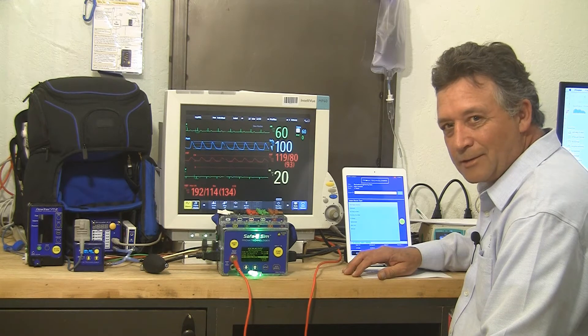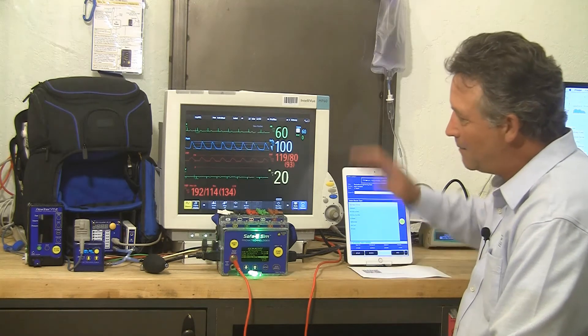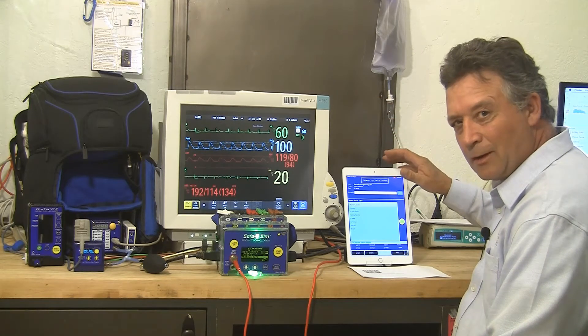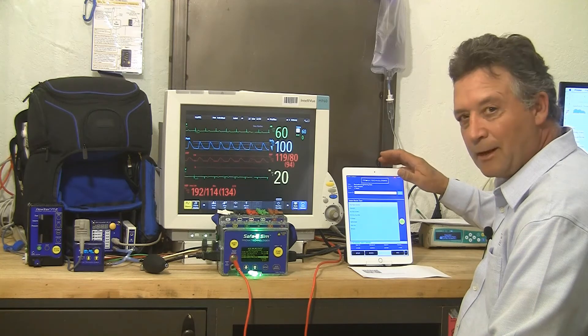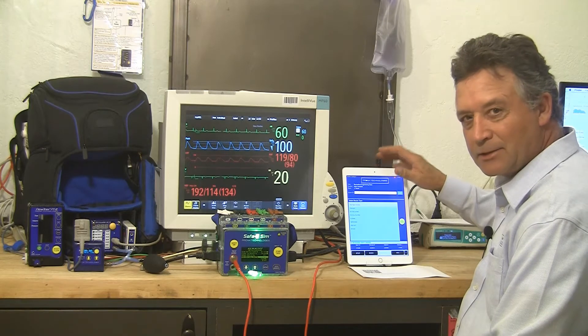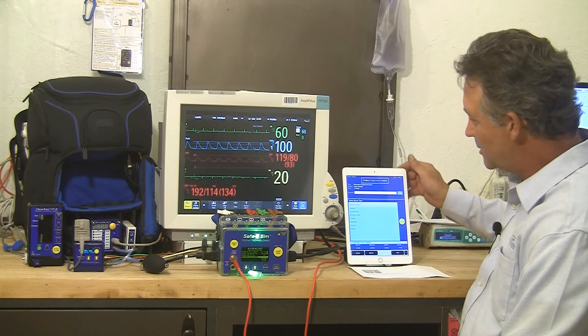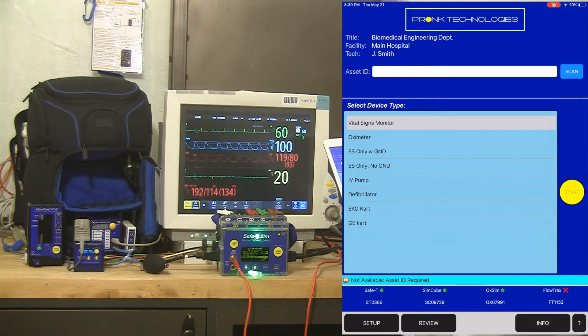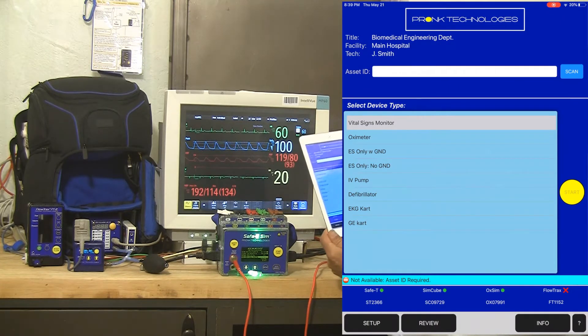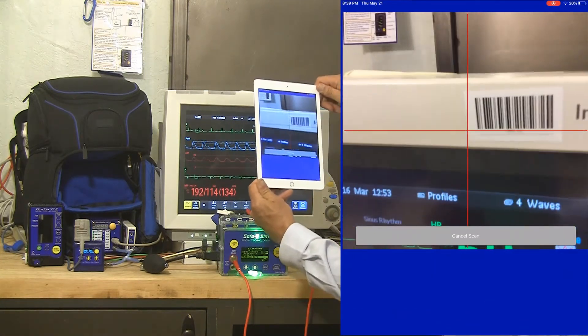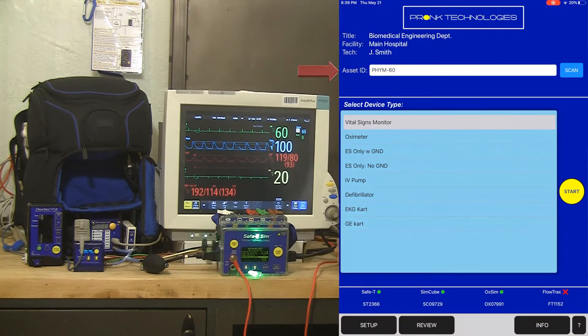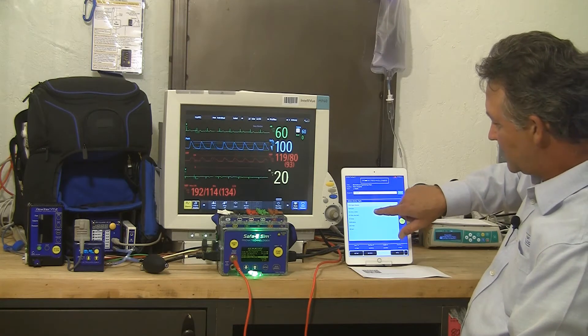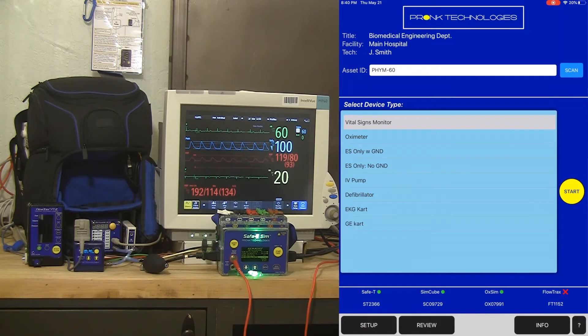All right, so let's take a look now at how we can do a complete PM on a Vital Signs monitor with the Pronk Mobilize wireless system that can run off of your iOS device, your iPad, your iPhone, either one. In this case, we're going to use the iPad because it's easier to see in the video. So let's just go ahead and get started. We're going to have a PM done from our iOS device with Bluetooth connectivity to all of our test devices. I'm going to start with a barcode scan of the device I'm about to test, get that asset ID tied into my electronic record that's going to build as we go. Then I'm going to select the device type on the iPad. That's Vital Signs monitor is already selected and hit start.